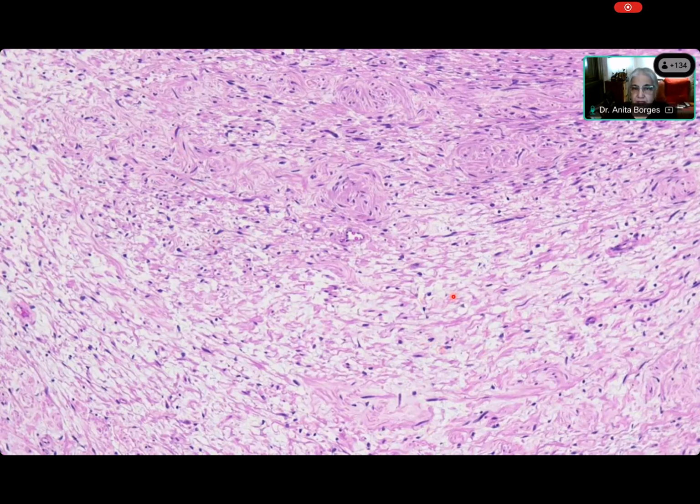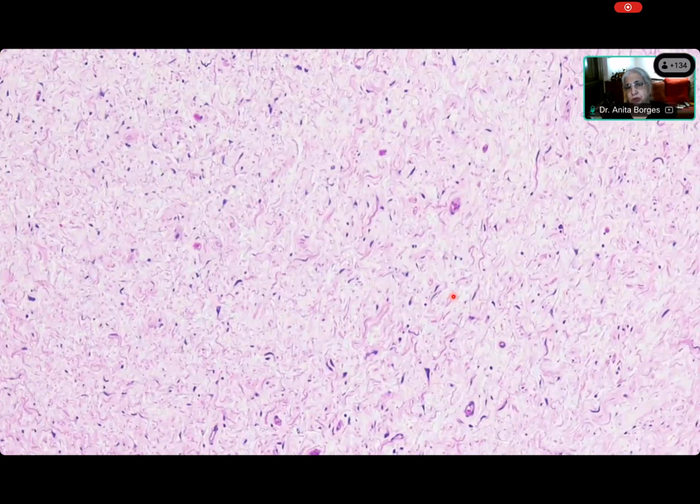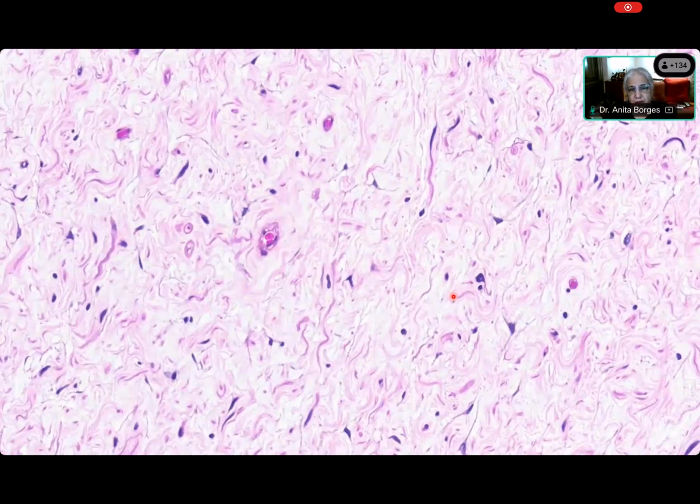And what is this tumor now? I don't think I need to labor the point. Look at the thinness of this nucleus. I mean, you just don't see nuclei that are as thin as this. And of course, look at the wavy cytoplasm. Look at the wavy collagen that you are seeing over here. And of course, the shredded carrot appearance.